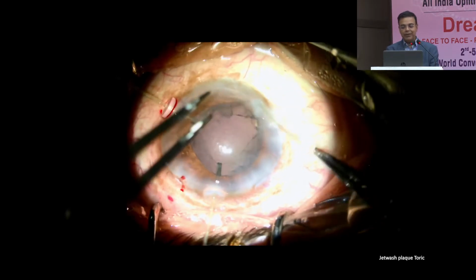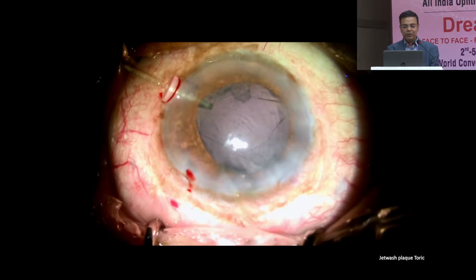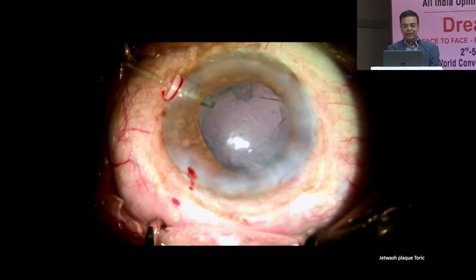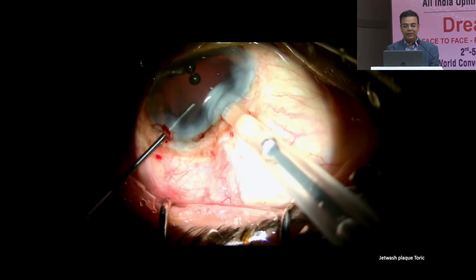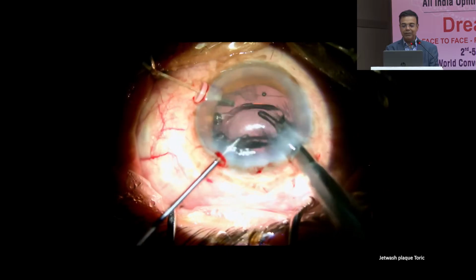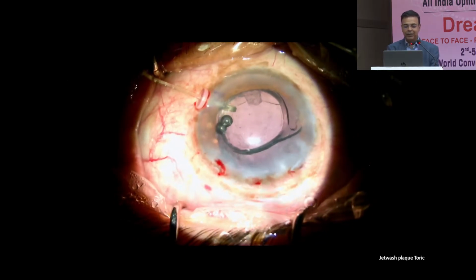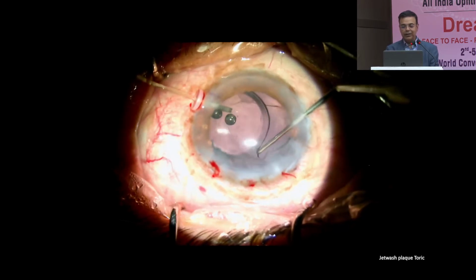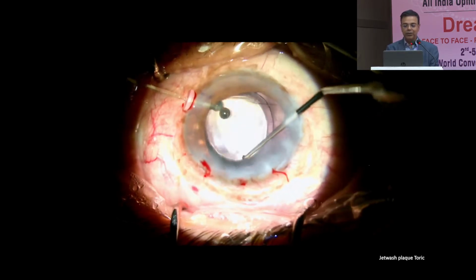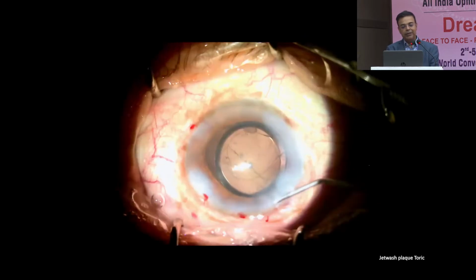All the same, we aborted the plan to put in a toric IOL here because it was not the most important thing. We had been able to do almost everything else, except I would have loved to put in a CTR, and at this point the thought did creep into my mind that I can just sacrifice the bag and go with some other form of fixation of the lens. But I decided against it because I felt that the capsular bag was stable enough not to dislocate very easily, and the patient was already about 80 years old, and I didn't want to prolong the surgery.